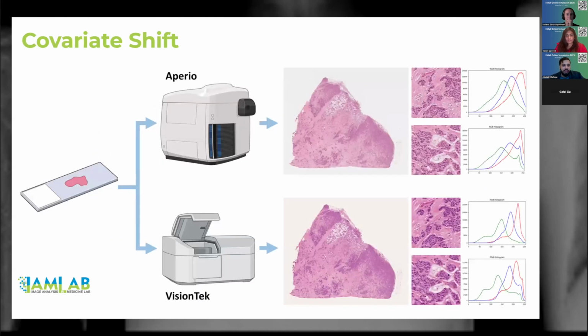In this study, we took the same glass slides and scanned them with two different scanners. We kept the staining protocol the same, so the only differentiating factor here is the scanner. As we can see, the same glass slide scanned with the two different scanners has very different color histograms for the same patches from the same location. Even for pathologists, if they observe the same slides under the microscope, they can see the same cellular morphology.